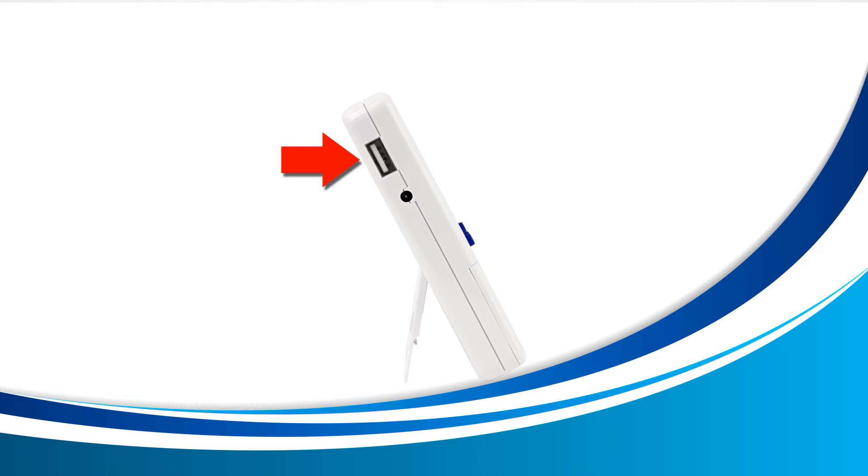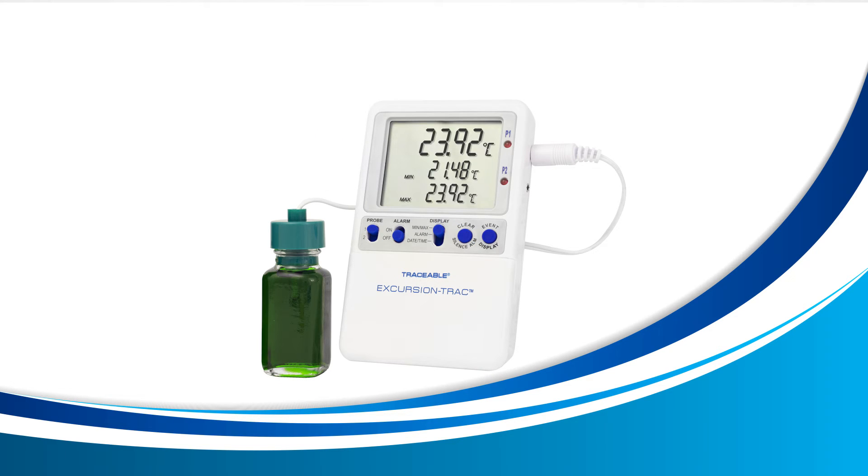This is where your USB drive will be inserted. When inserting your USB drive, never force it in as it should slide in easily.